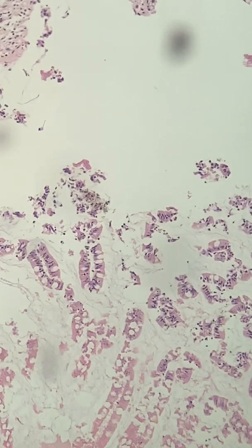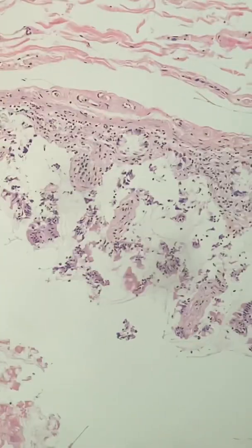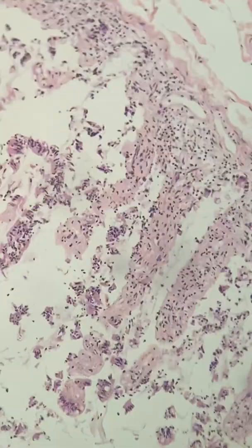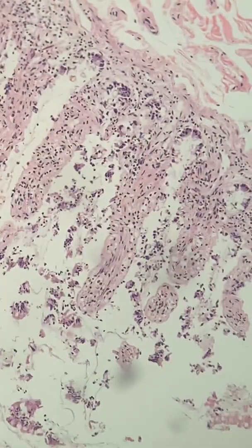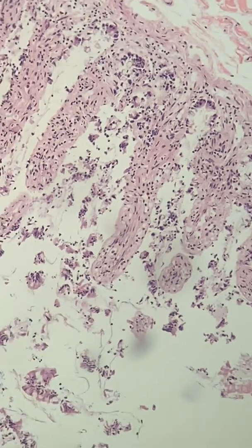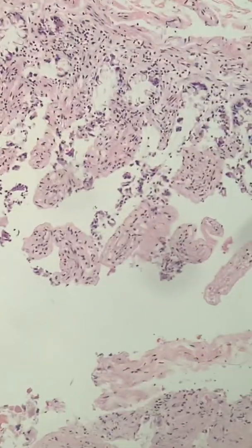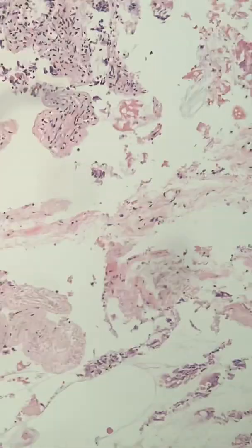Again, most people would say the person probably had some sort of underlying chronic disease, and there's absolutely no evidence of that in these histology sections, and even in the gross examination. The other organs other than the lungs were perfectly normal, and obviously the hematolymphoid system, the spleen, and I'm going to show you a lymph node eventually, and the bone marrow. But this is normal small bowel intestine. Okay.